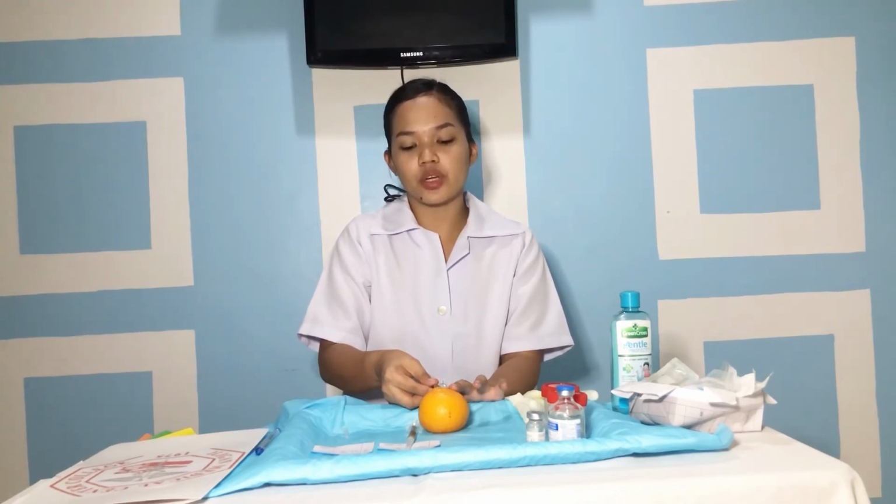So advance it through the epidermis to approximately 1/8 inch below the skin surface. So by that, we can see the needle tip through the skin. So this will ensure that the needle tip is in the dermis.